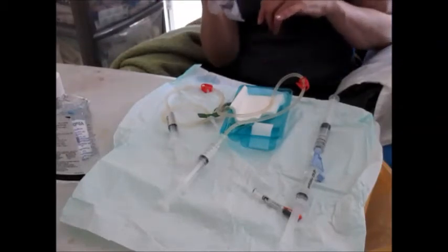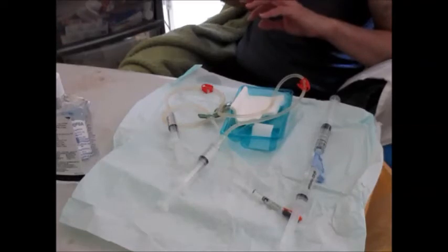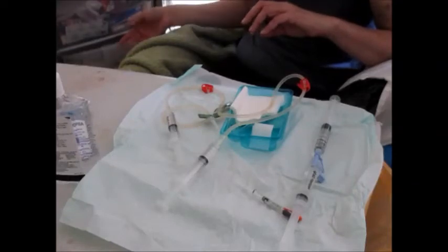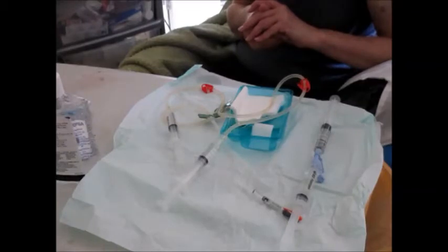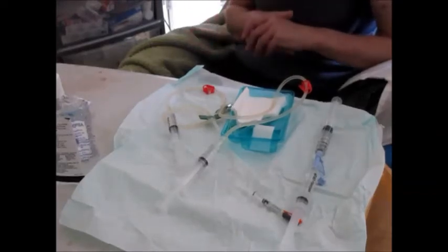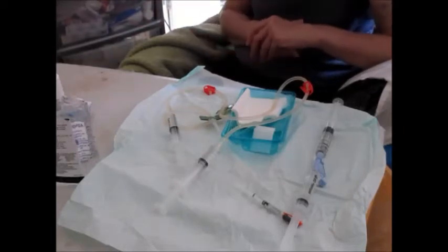When I've drawn up the saline, I pop it in the plastic drawer at the side of me. I usually have next to me all the spares I might need during treatment: spare sani cloths, syringes, needles, tape, swabs — I have plenty of swabs — should I have any excess bleeding from my access at the end of treatment. I've learned over the years to always be prepared for any event and have plenty of spare packs as well.